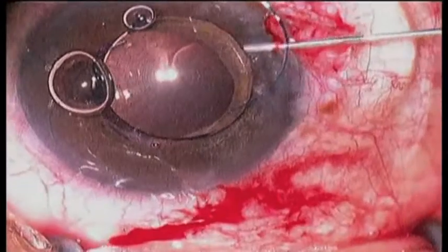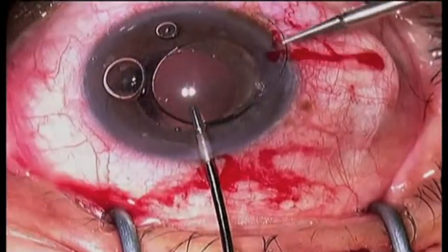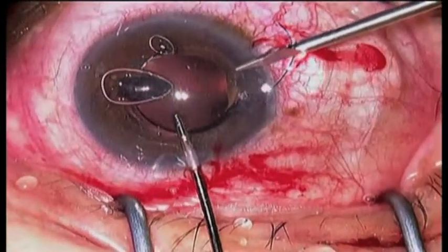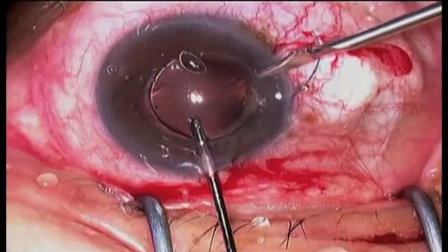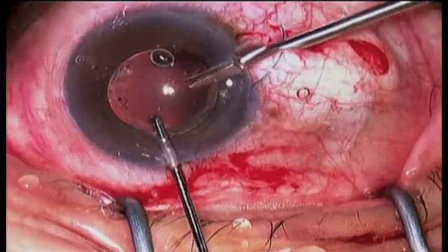Here we're going to put viscoelastic under the lens to protect the capsule and over to protect the endothelium. The Packer Chang 19-gauge scissor is used to cut this lens in half while it is held in place with MST micro forceps.